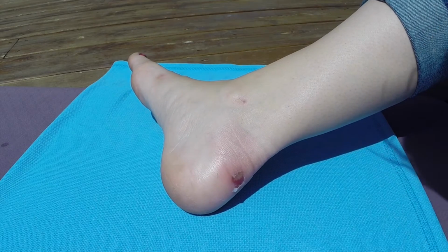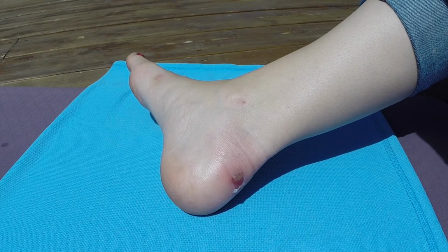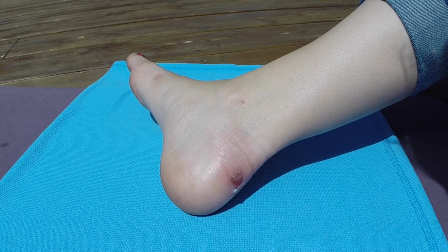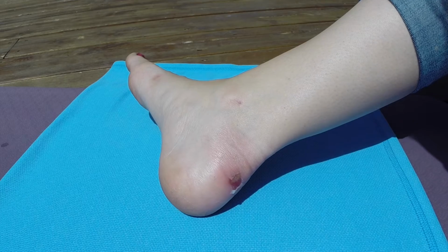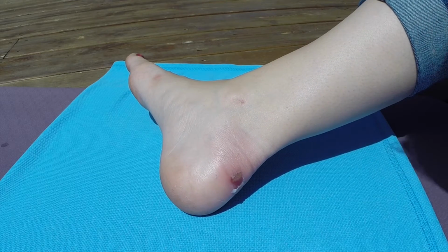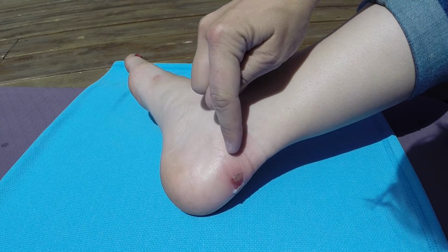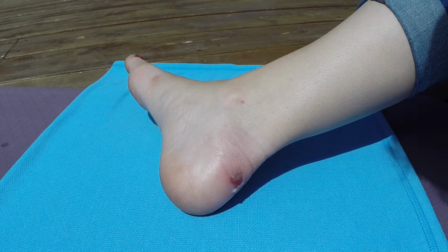So first thing you want to do is clean the wound really well with soap and water. You don't want to use things like alcohols because it's going to damage the healthy cells and delay the healing process. So just use soap and water to clean it out. You can see where the wound itself is pretty clean. We got a little bit of glue around the outside, but that's alright.